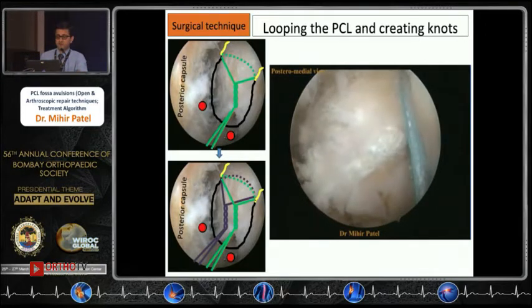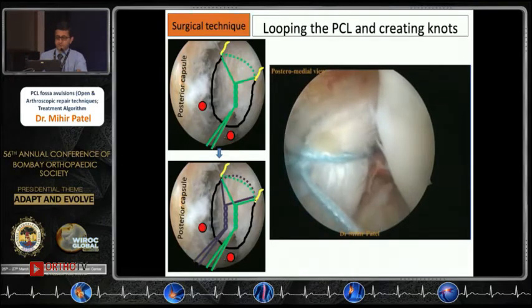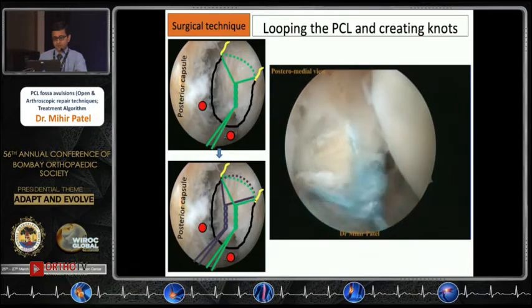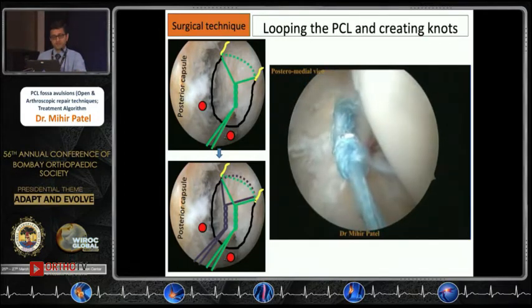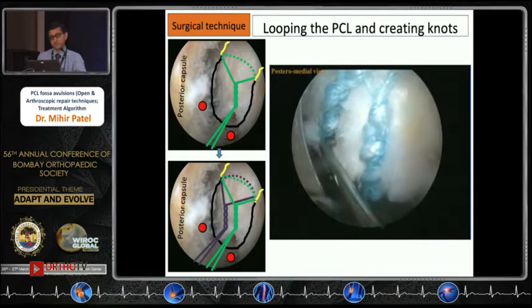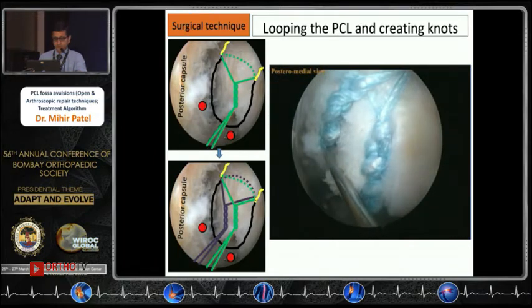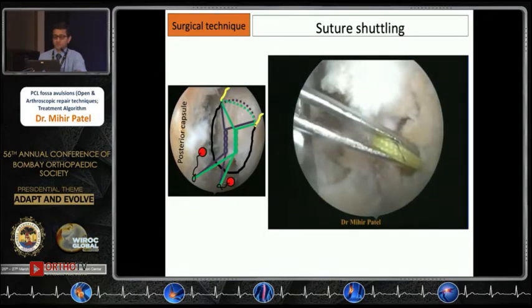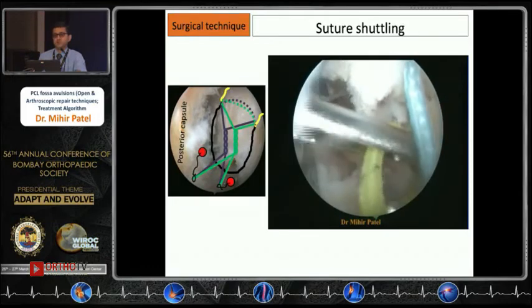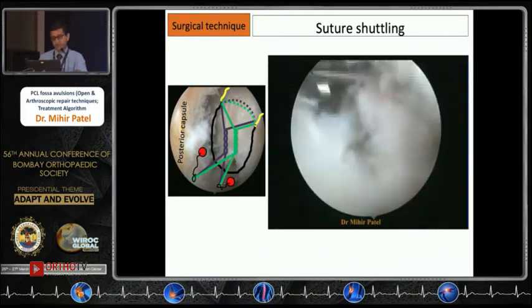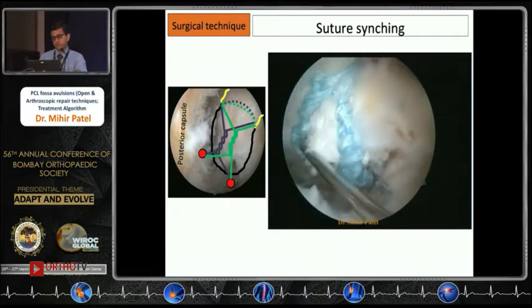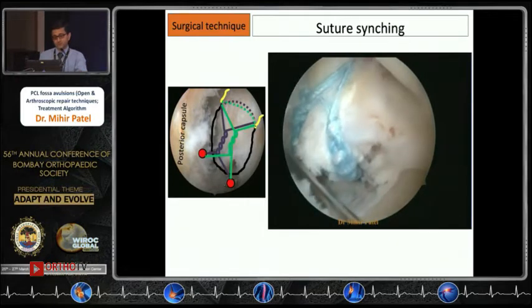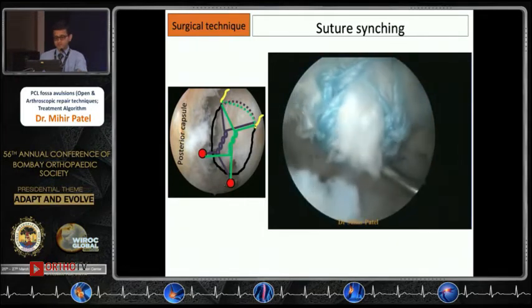A series of four to five half-hitches are pushed into the joint, lying on the bony fragment posteriorly. The same steps are repeated for a second number-two FiberWire, creating two knot bundles posterior to the PCL bony fragment. Two suture shuttles are advanced into the posterior compartment and used to pull one suture of each bundle into the anterior compartment. As the two sutures are cinched, the two knot bundles nicely compress the PCL fragment into its fracture crater, giving anatomical reduction and very stable fixation.